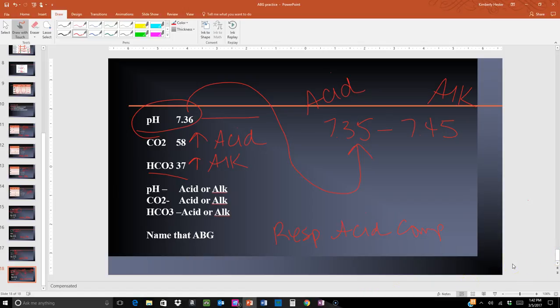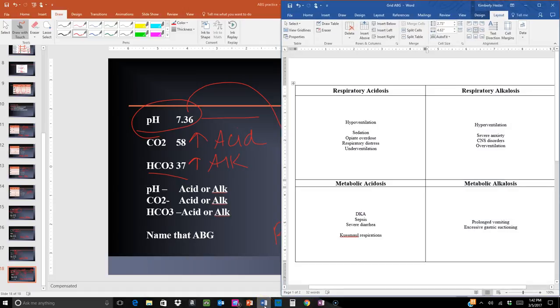All right, so we just want to go back real quick before I end the video and talk a little bit one more time about the different types of patients. Say you come in the morning and you're in the ICU, and the patient's on the ventilator, and the ABG showed some respiratory acidosis.